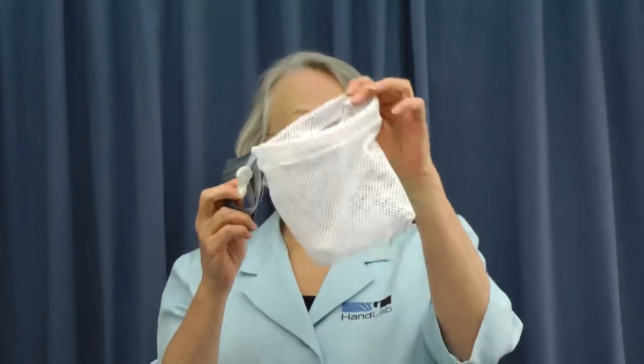The MetaGrip is easy to keep clean. You simply remove the MetaGrip, and you can either wash it by hand in hot soapy water, or if you close the straps, you can place the MetaGrip in a mesh laundry bag and place this mesh bag in the washing machine. You'd like to wash it on a gentle cycle, delicate, with temperature no greater than 104 degrees.